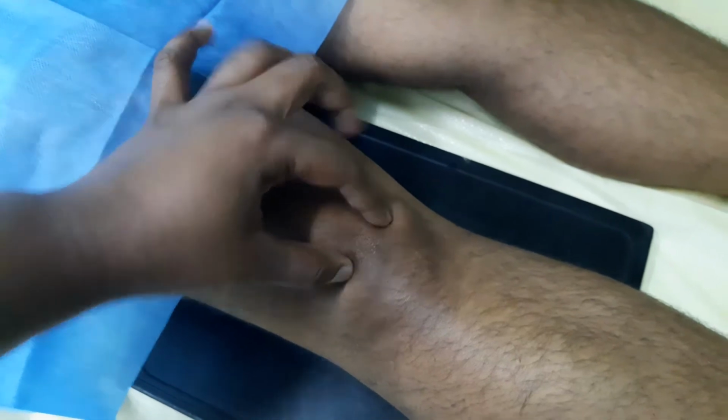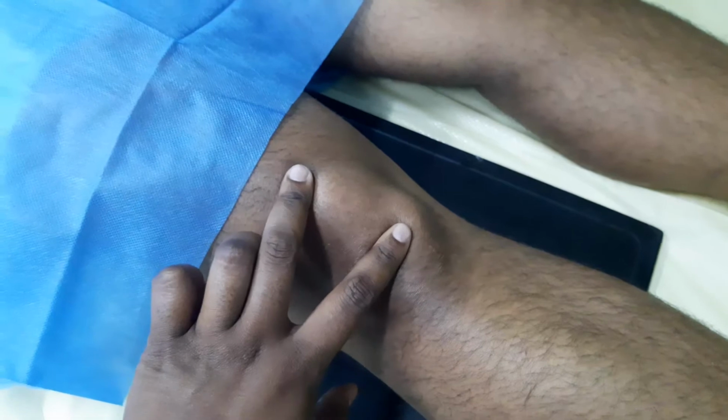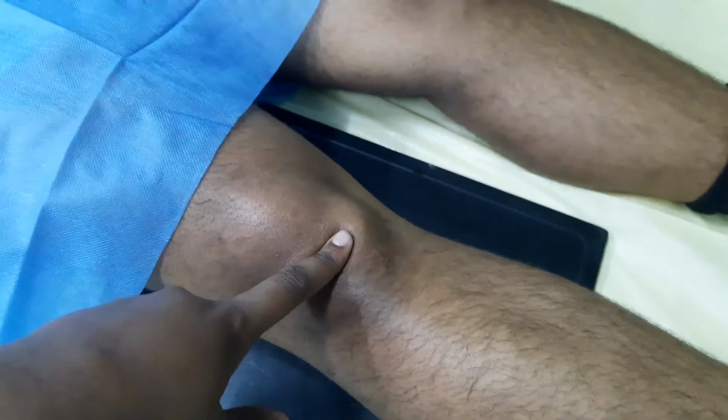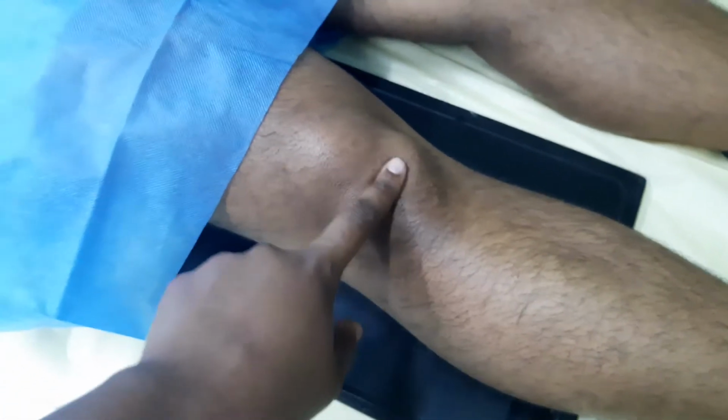And you work your way out. This is the apex of the patella. This is the entire joint here, the entire bone here. Right? Apex of the patella, and you measure about a finger width or so, estimate half inch. So the knee joint is here. Now some patients, you may not even feel the patella, based on the size of the leg.